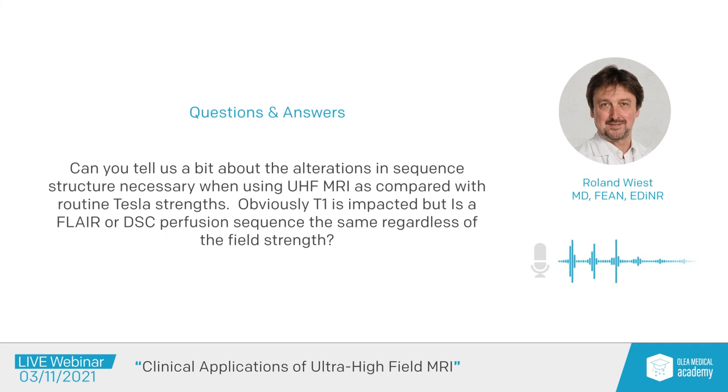So just to be honest, we don't have the DSC perfusion installed, right? So this is something we do not use. It's not working in our setting at the moment. Regarding the rest, I think that the major impact is the time. So the acquisition of the sequences is longer. For example, if you have a T2 high resolution image, we really need to take into account that the sequence takes up to 11 or 12 minutes in a good quality.